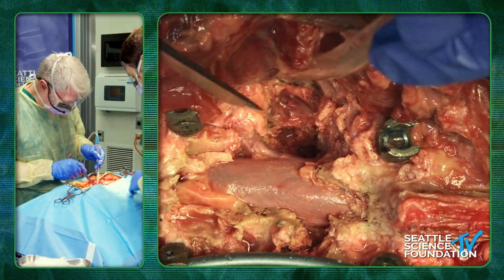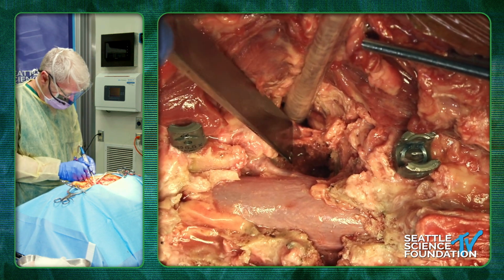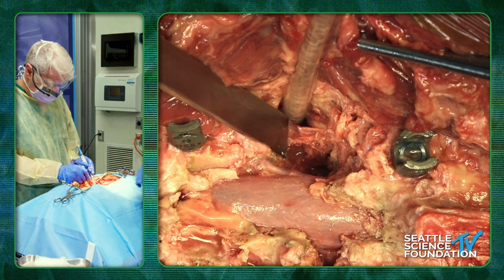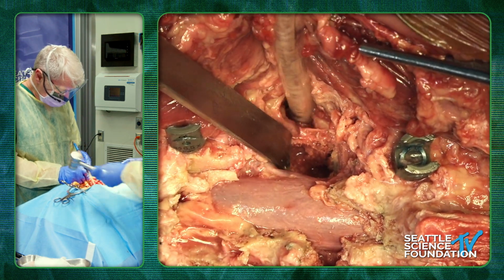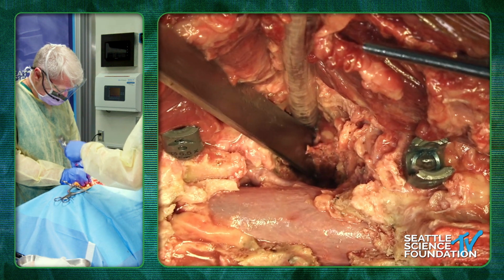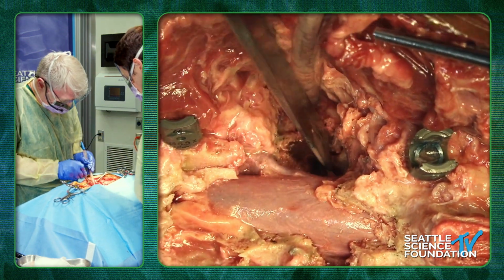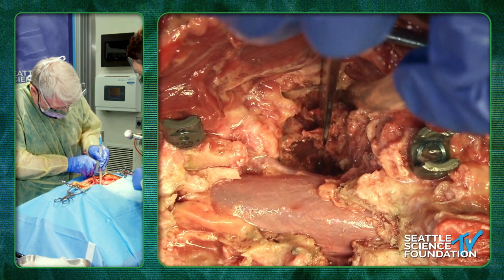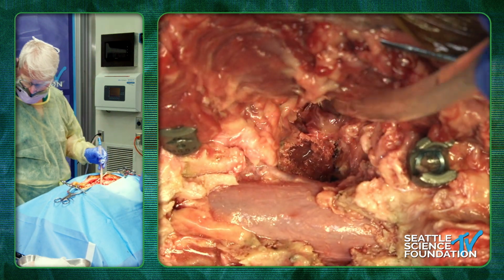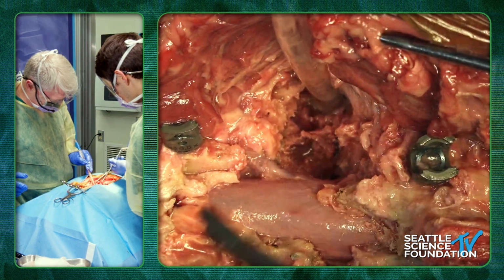Okay, so I don't know if you guys can see. So what I have here, can you guys see? Yes, quite well. Okay, so here's the lateral wall. So I'm going to triangulate that a little bit more. So we're going to osteotome this. And again. Okay. The pituitary or something. You want to take that out?